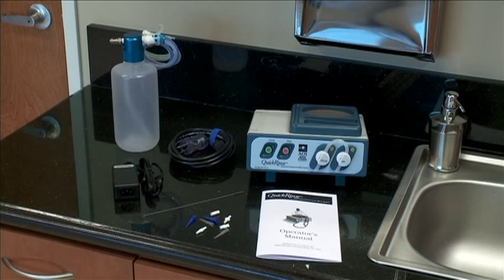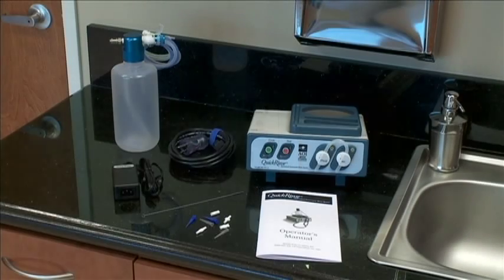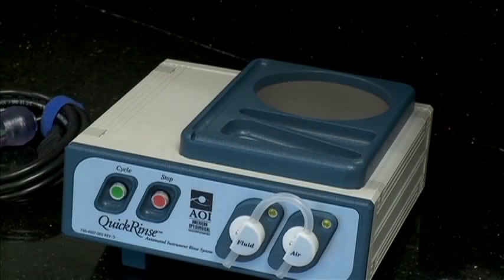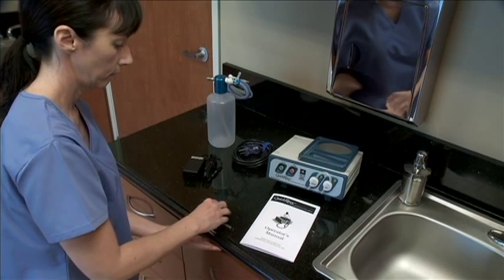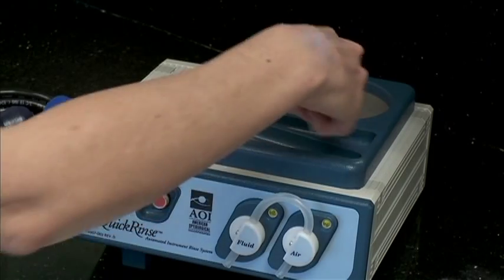Setting up the Quick Rinse system can be covered in six simple steps. But first, place the unit and parts on a flat surface near an appropriate electrical outlet, and make sure to place within reasonable distance to a sink or drain system. Now would be a good time to place the cleaning brush alongside the container in the appropriate storing compartment on the top panel. Then place the nozzles and adapters into the storage compartment, also on the top panel.